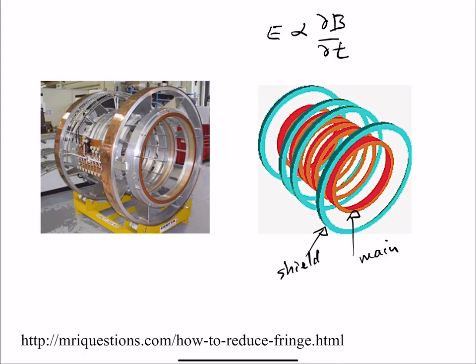The other thing that anyone who does MRI for a long time does is you will probably demagnetize your credit cards at least once. I've done it probably twice in my 20 years of doing this, and it's because you get a little close to the magnet and it just demagnetizes your cards. It's a real hassle. So after one or two times, you remember to just take everything out.